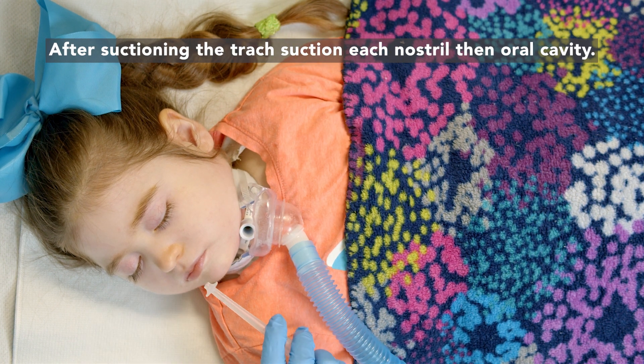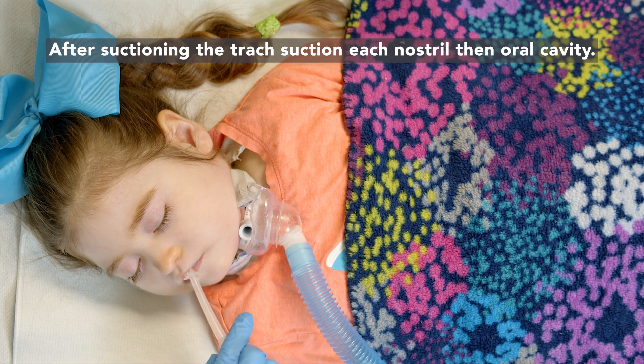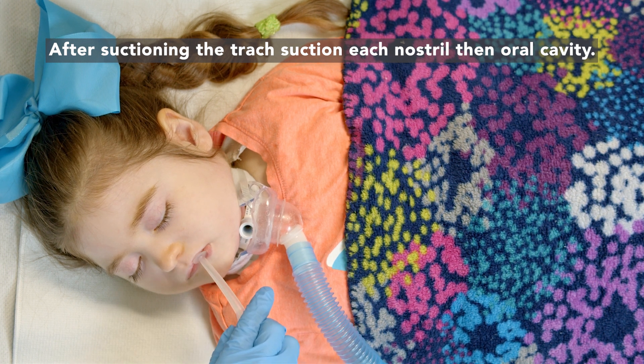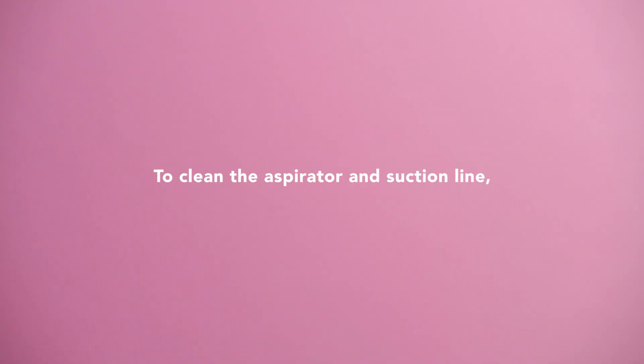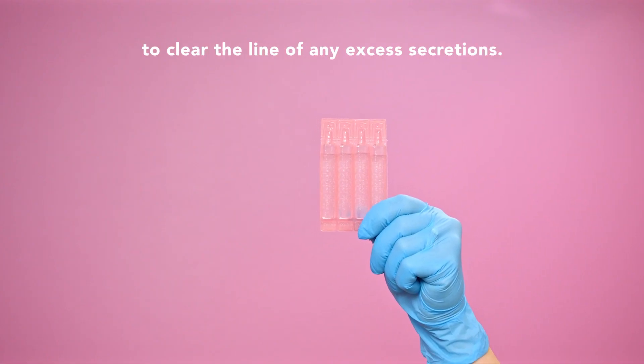Never hold the aspirator on the trach for more than three seconds. After suctioning the trach, suction each nostril, then the oral cavity. To clean the aspirator and suction line, use the pink bullets of saline to clear the line of any excess secretions. Turn off the suction.